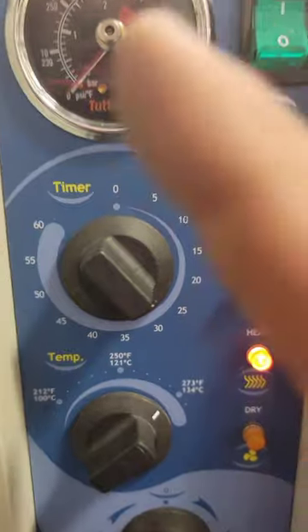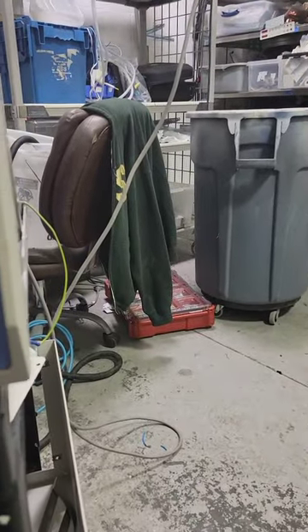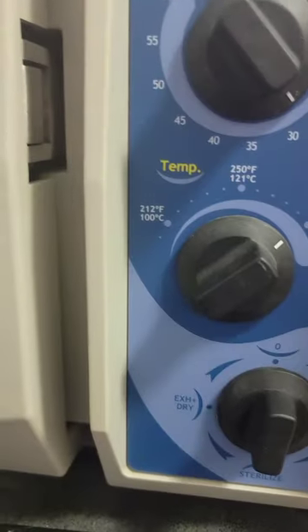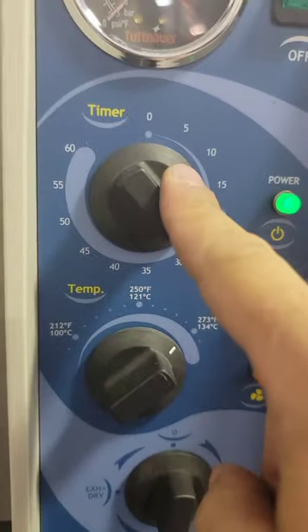You don't want to sterilize for too long or too short. The instruments you're putting in here come with an IFU — instructions for use — which specifically tells you what type of sterilizer you can use: steam, ethylene oxide, pre-vac, gravity, et cetera. It also tells you what temperature to be at and how long.